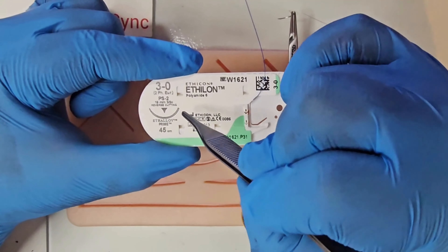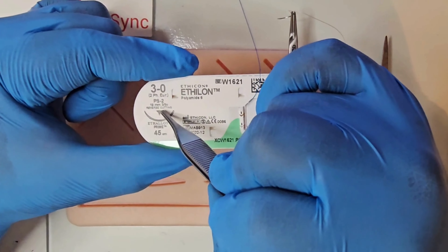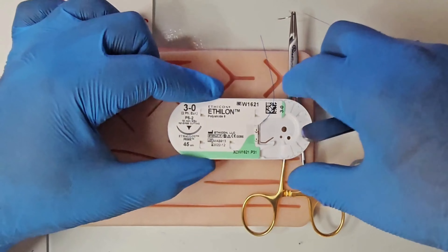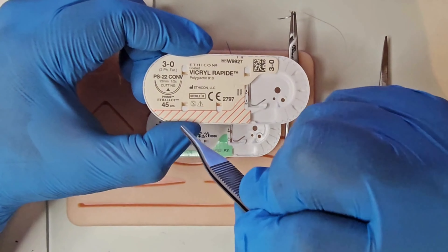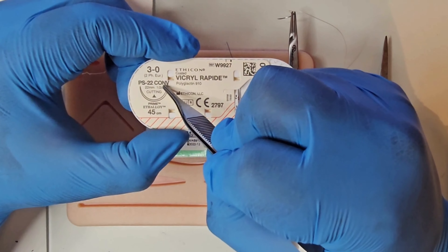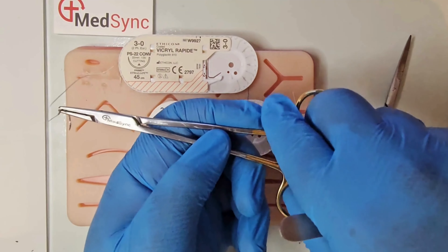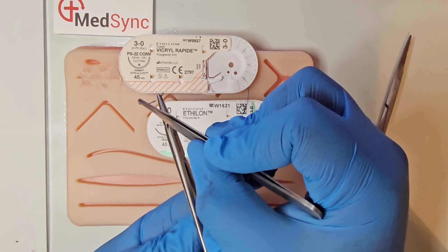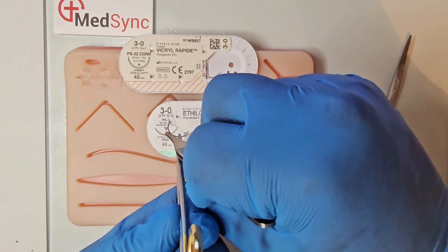Sutures have several sizes. The number refers to the USP — the strength required to break the suture. It will tell you the needle size in millimetres, the needle type such as reverse cutting, and illustrate a picture. A cutting needle means the sharp edge is on the inside of the curve; reverse cutting is where the sharp edge is on the outside of the needle.